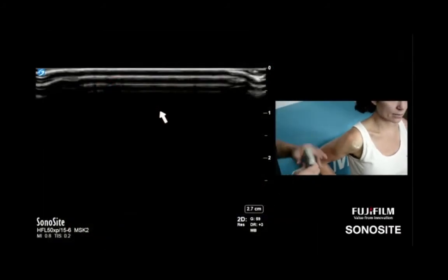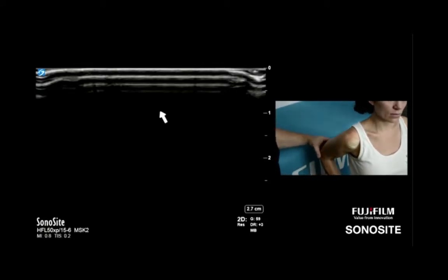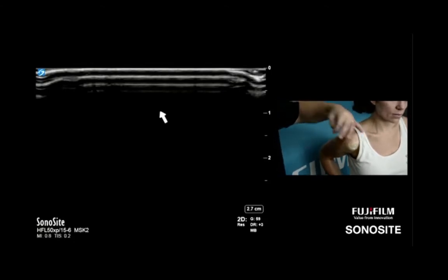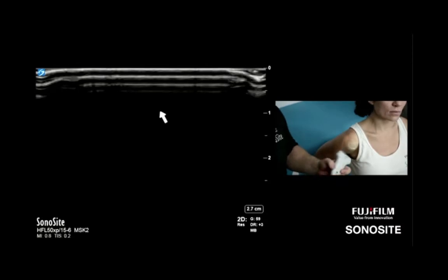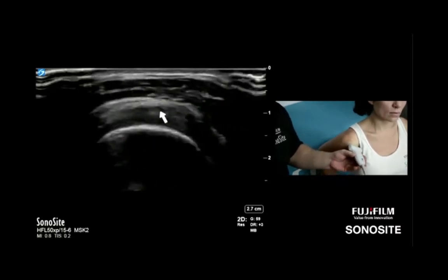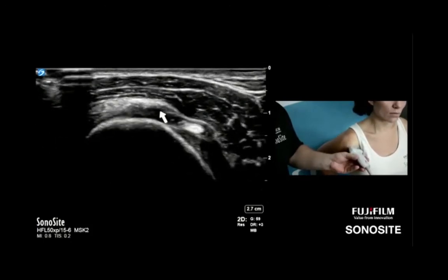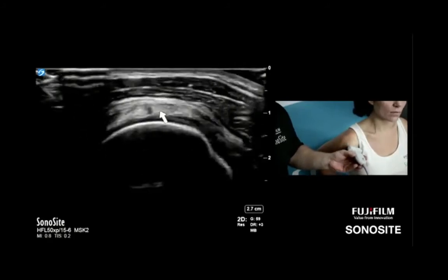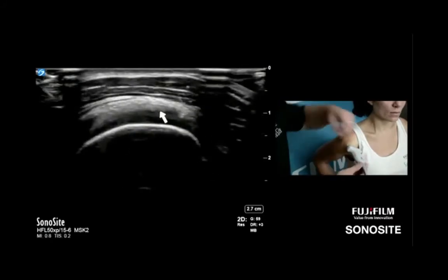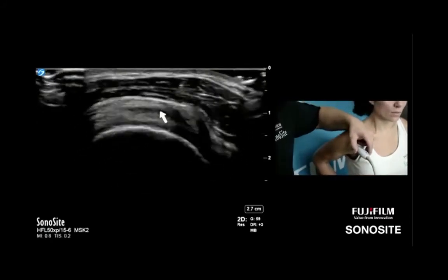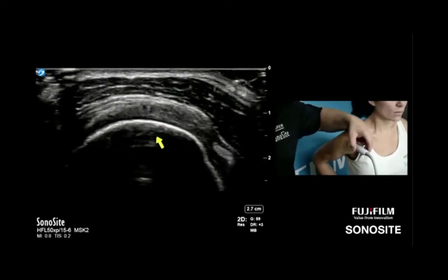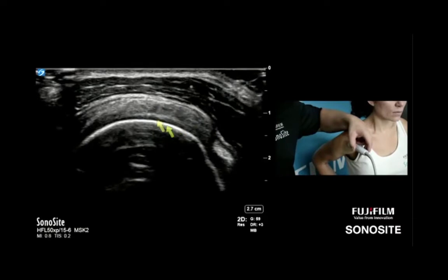Daniel: Changing Jamie to the modified crass position — palm in the back pocket, elbow not out — internally rotating the cuff. Let's bring Jamie's elbow toward her spine to bring the cuff structures out where we can more clearly see them. I like to go find the biceps first — everything starts at the biceps. There's the biceps, and the arrow is already right over the supraspinatus. Switching hands to get more comfortable, starting in transverse plane on the supraspinatus so I can see the entire volume of the rotator cuff in one shot.